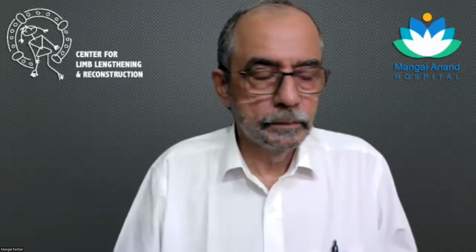Can you hear me? Yes. So now I have realized that in the Indian patients, the North Indian patients that we get, putting a screw in the transverse part of the plate, not more than 50, solves the problem for me. And if we keep the plate away from the bone to change the direction in relation to the proximal tibia, that makes the plate very prominent, especially in the ladies.